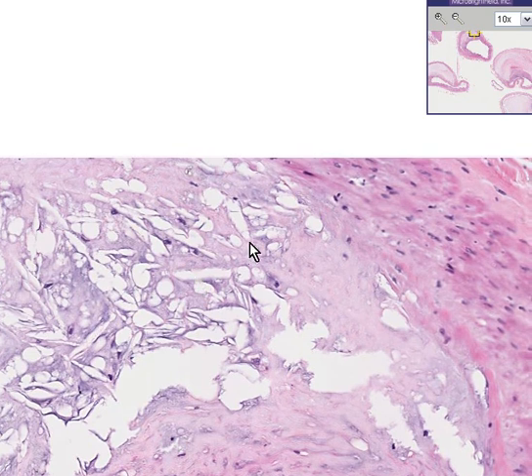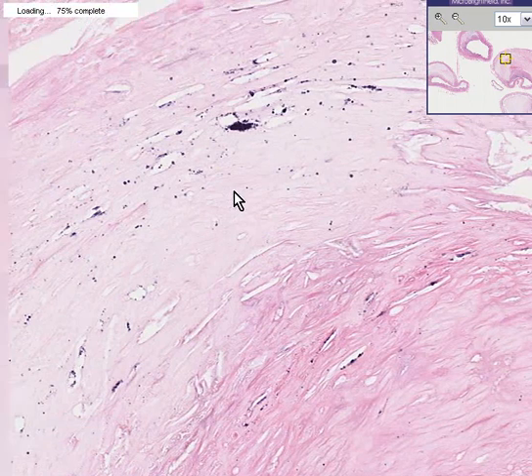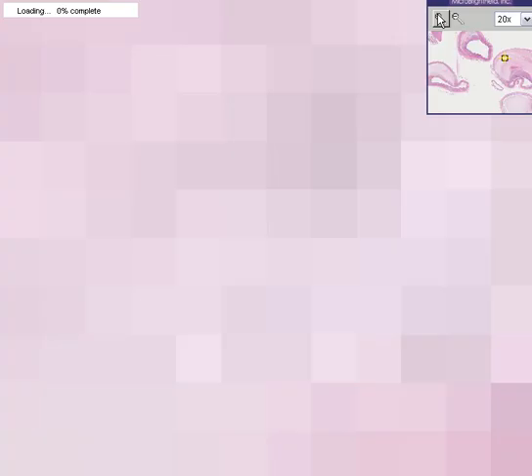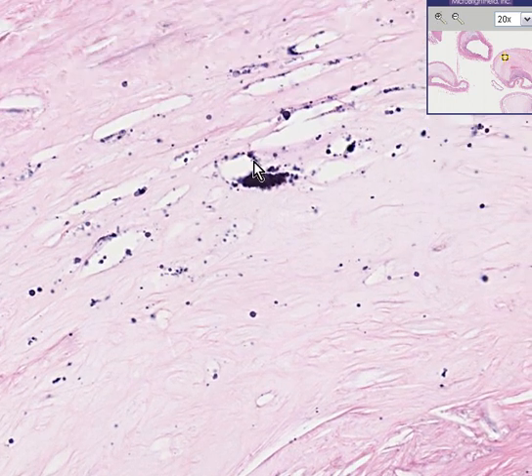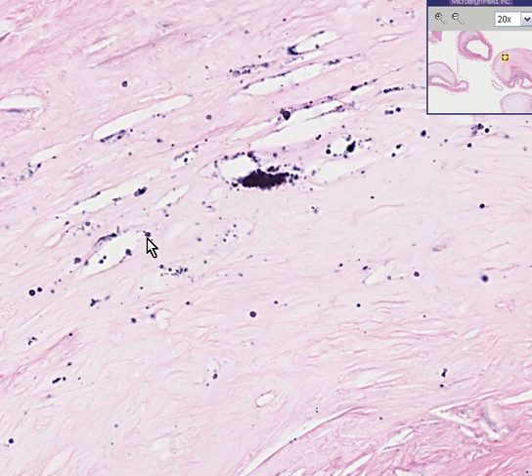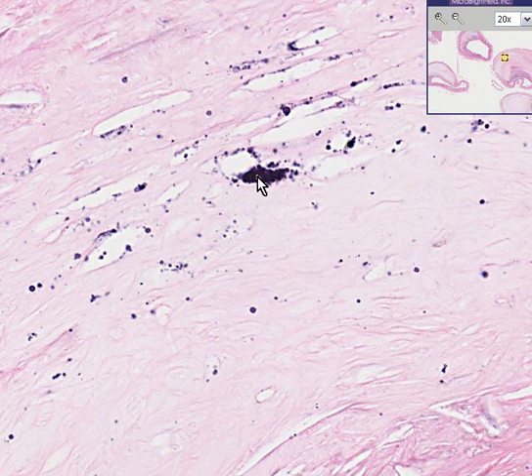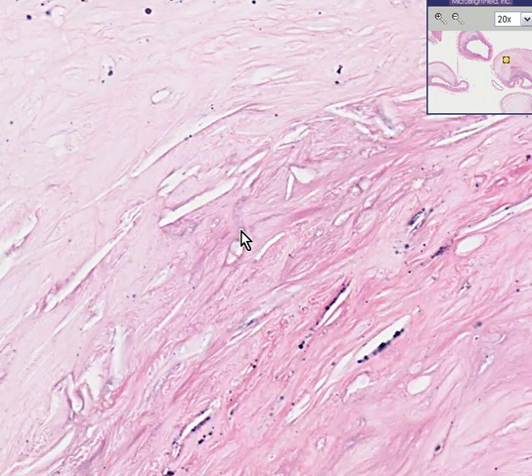Even though it didn't look originally like there was a ton of calcium in here, when you zoom in a little bit you can see all these very dark blackish-blue areas, which are quite typical of early calcium deposition as well. And here are some more cholesterol clefts down here.